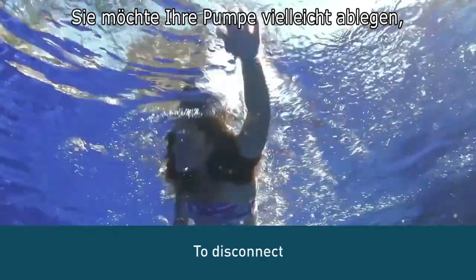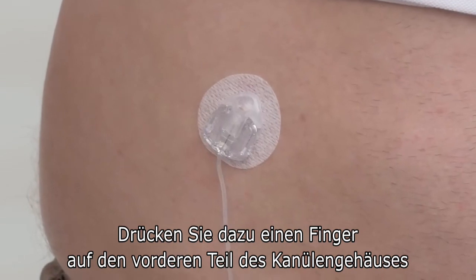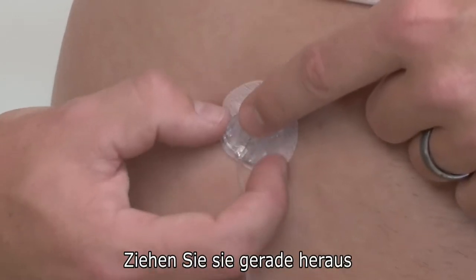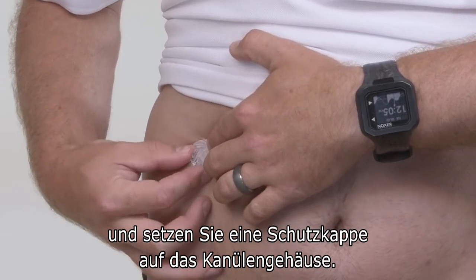You may want to temporarily disconnect from your pump at times such as showering, swimming, and contact sports. To disconnect, place a finger just in front of the cannula housing and gently squeeze the sides of the connector needle. Pull the connector needle straight out and insert the disconnect cover into the cannula housing.